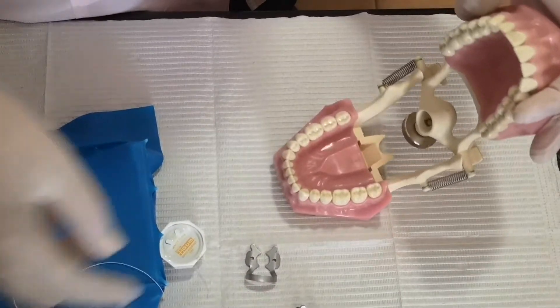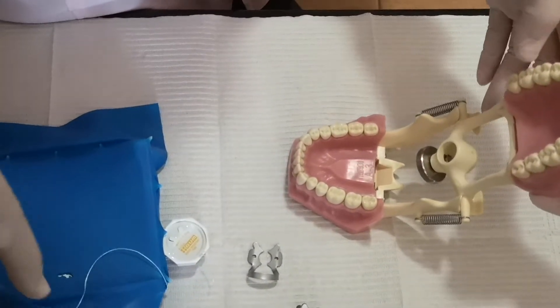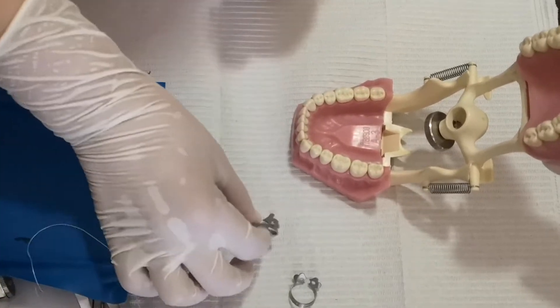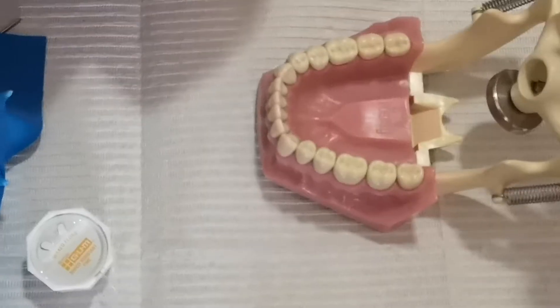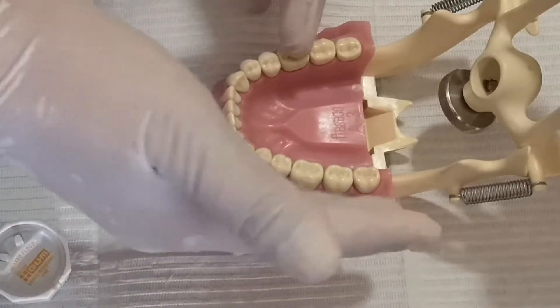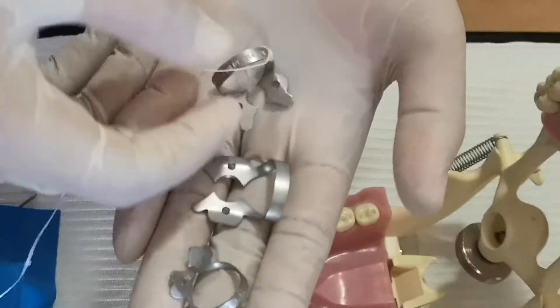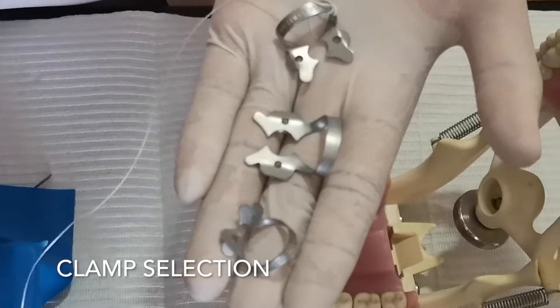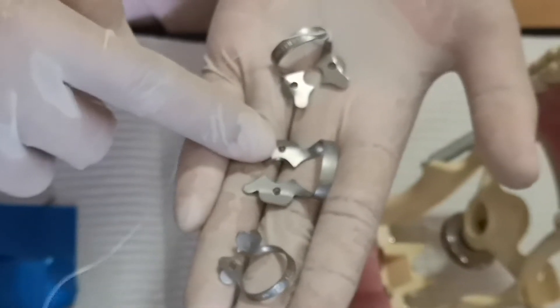Now I'm going to demonstrate how to do it on a molar or premolar — on the posterior tooth. For example, I'm going to do it on tooth 36. First, make sure it's clean. Next, select from your clamps. I have three clamps here, and the best clamp that will fit the mesiodistal width of this molar is this one.